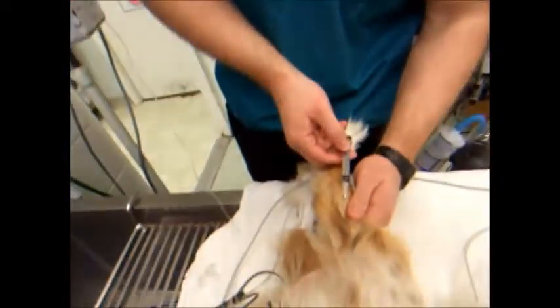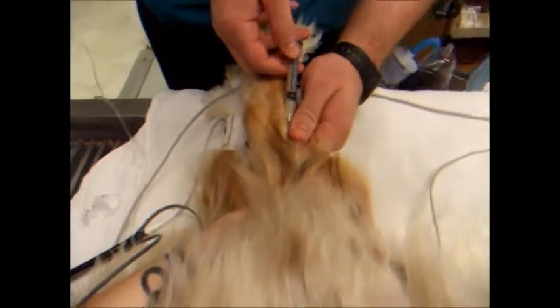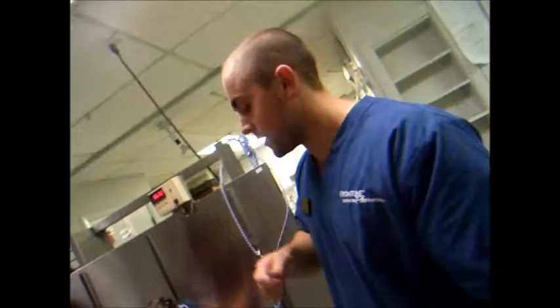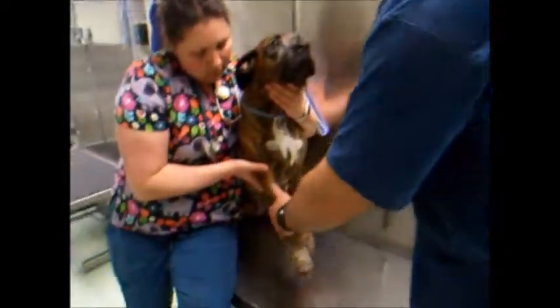I'm going to pull some blood from a saphenous vein of a dog here. And draw blood from the cephalic vein of a dog.